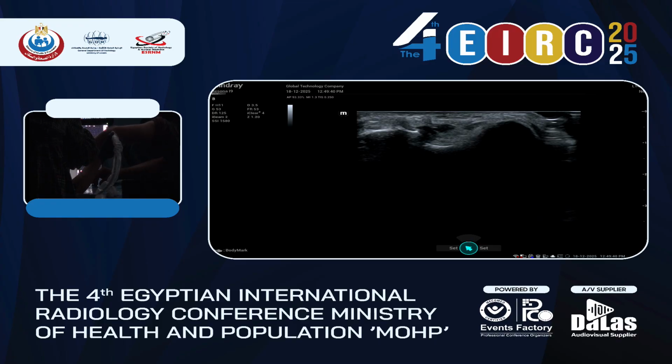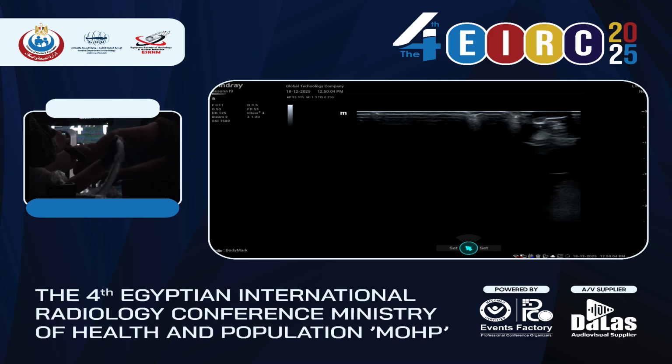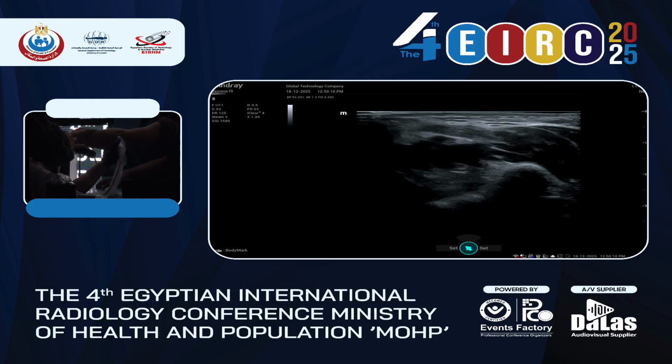The trick I suggest to test for instability is that you hold your probe with your 3 fingers like that. This is the 3-finger technique of holding the probe. So you hold the probe with 3 fingers as if you're holding a pencil with your right hand. The 2 fingers rest against the patient's arm, and that helps you stabilize yourself. And your elbow holds against the bed.